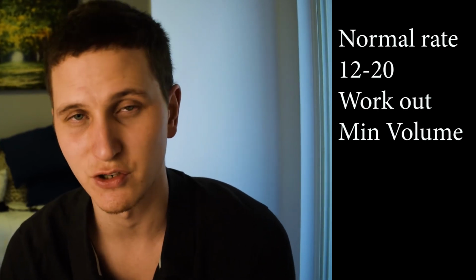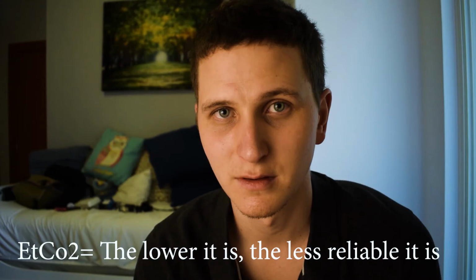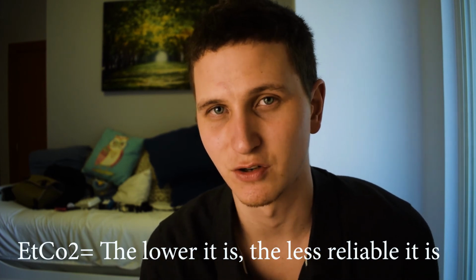So you want to keep smaller ventilations at a good rate, maybe 12, 15, making sure that your saturation is good, making sure that your EtCO2 is good. If you have a capnography of between 35 and 45, you're in a good place, with obviously a good blood pressure. And so if you have a protective lung strategy, you're wanting to be working on smaller tidal volumes so that you can then breathe faster, because you need to treat them like baby lungs. It's a thing to remember.